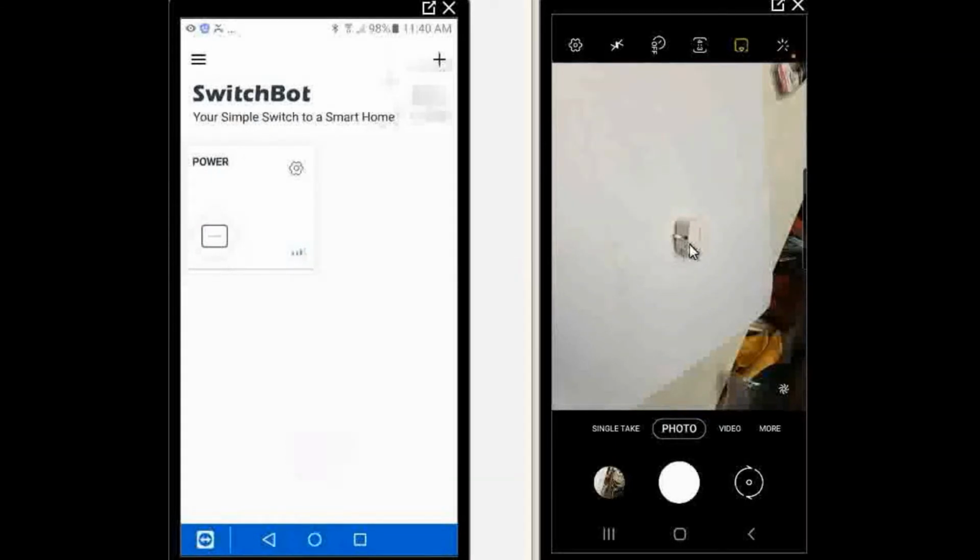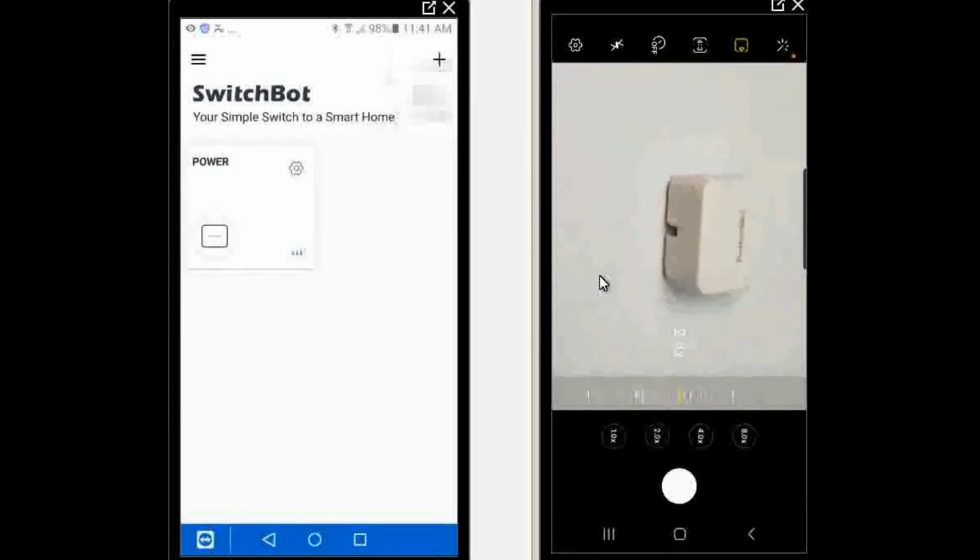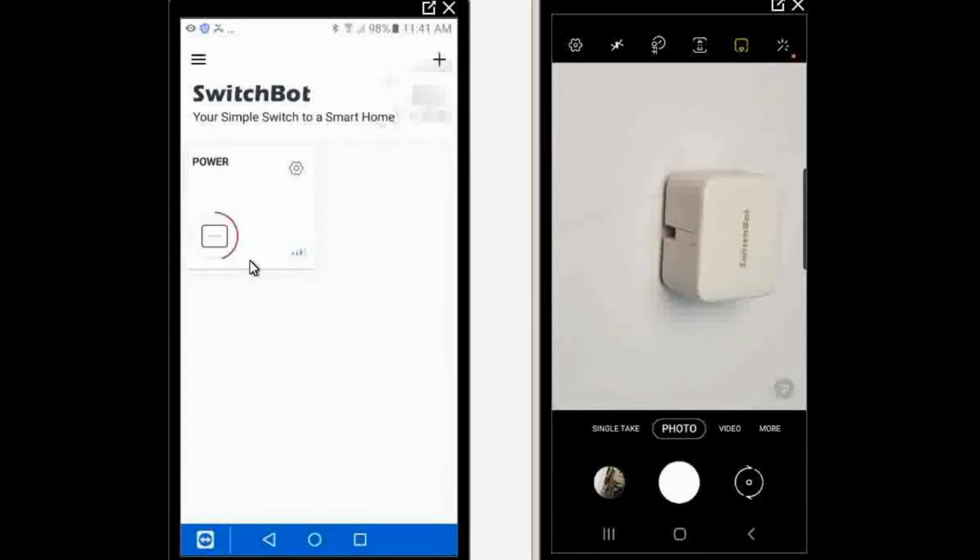Alright, and then I'm going to click this little icon right there to the right of bot 80. Okay, now it went down. Took a couple of times because this is the first time this device has been communicated with. Now if I do it again, and I'll make it a little larger so you can see it better, I'll click it again. Hopefully this time it'll go quickly. There you go. And what this device is doing is pushing the button on the autorefractor.